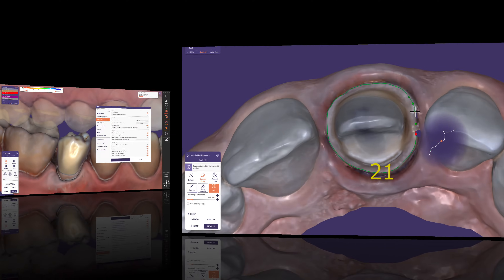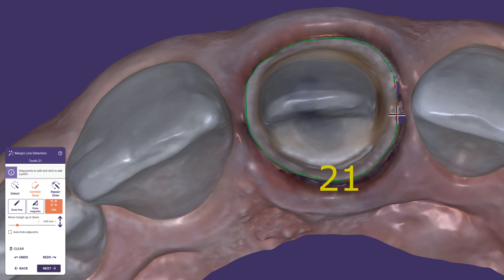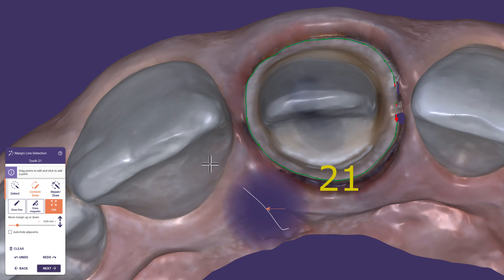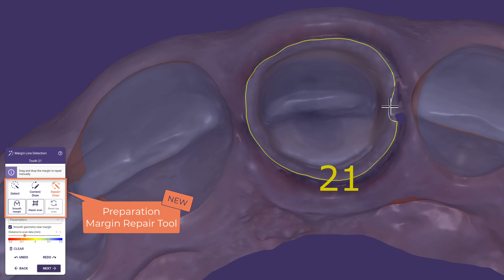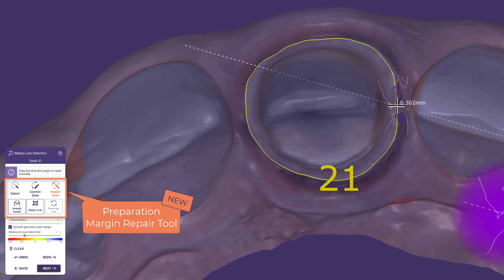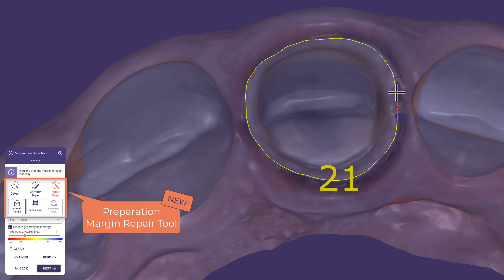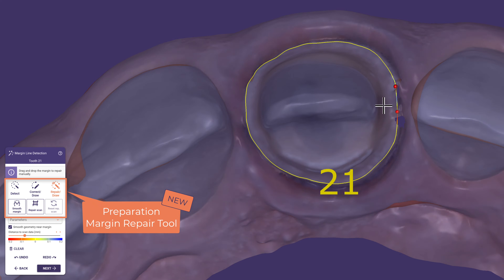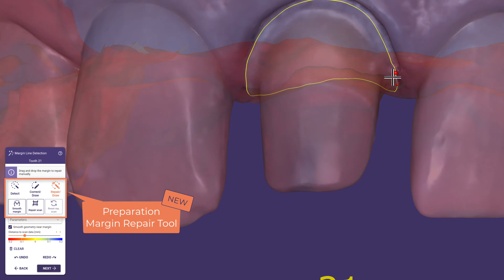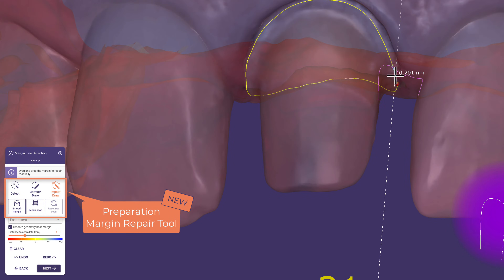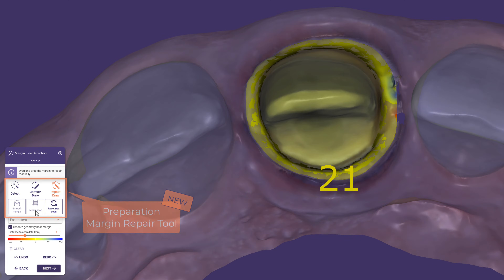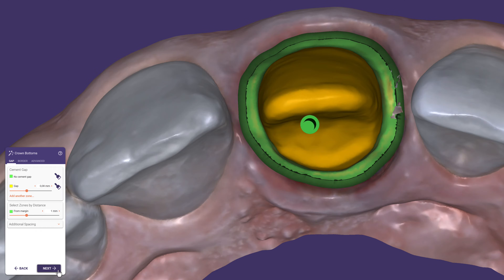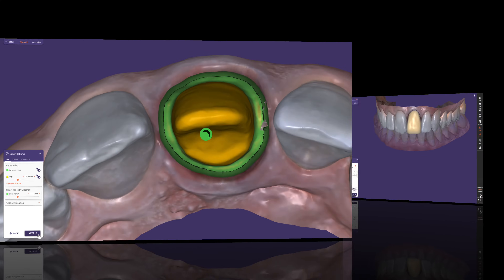Get the most out of imperfect intra-oral scans with the new preparation margin repair tool. This new feature has the ability to lift or extend the scan along the margin line to get an acceptable result despite artifacts or holes in the scan. This allows you to deliver restorations even if the scan you receive is suboptimal.